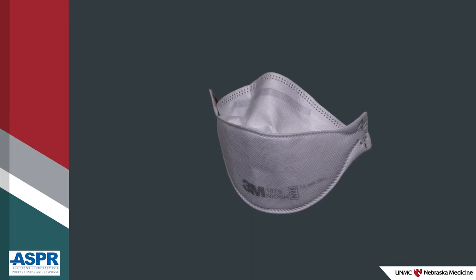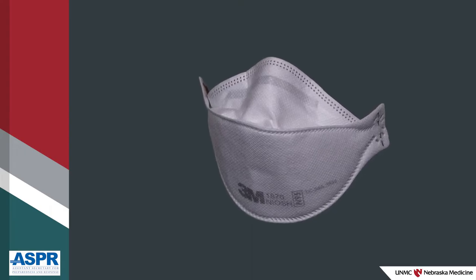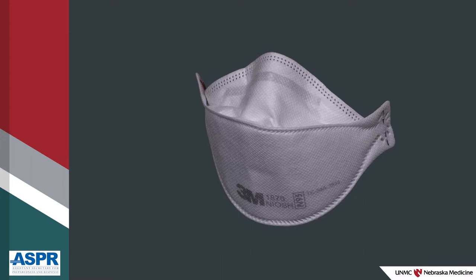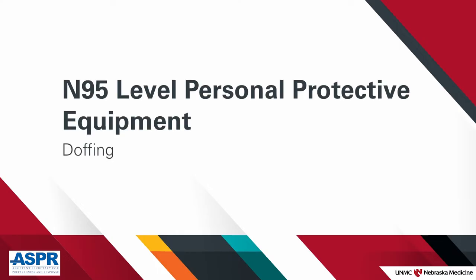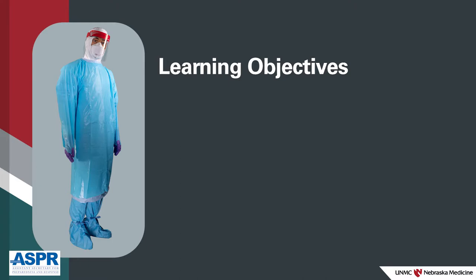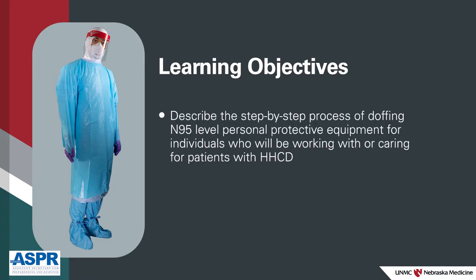In this video, we'll review doffing N95-level PPE that can be worn while caring for a patient with a highly hazardous communicable disease, or HHCD. By the end of this video, participants will be able to describe the step-by-step process of doffing N95-level PPE for individuals who will be working with, or caring for, patients with HHCD.